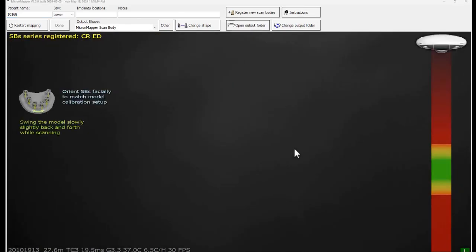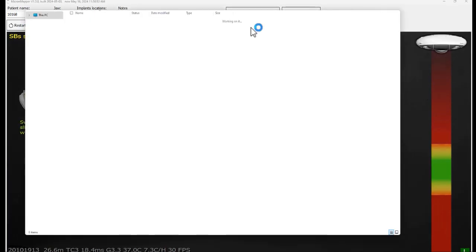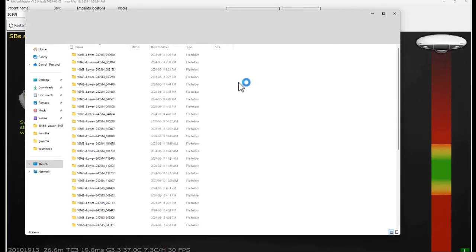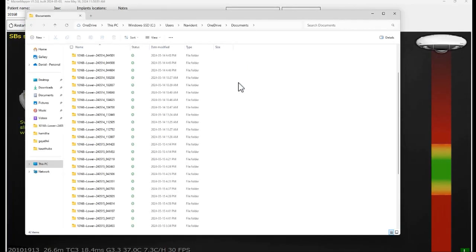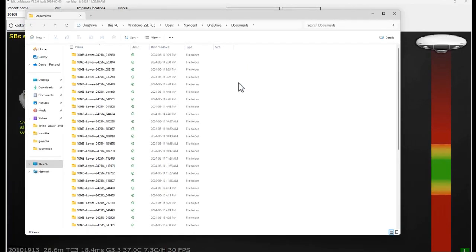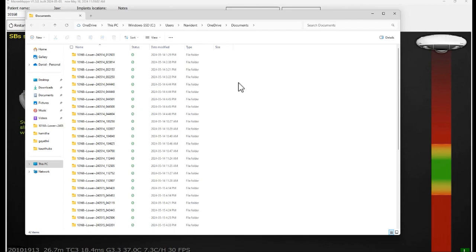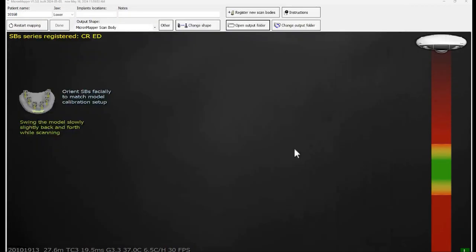To see the results of the calibration and mapping, click on the open output folder. You can see all the results of the tests done. The name of the file consists of the patient name, jaw type selected, implant if mentioned, notes if mentioned, and the date and time.